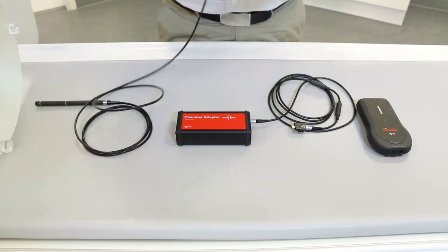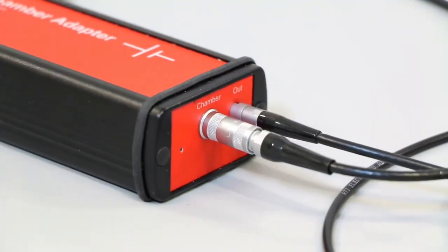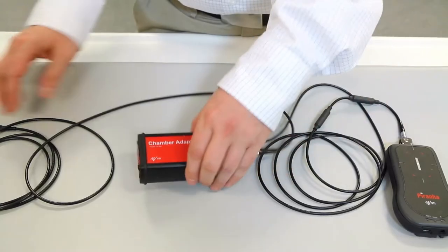To begin your first measurement, plug in the CT-Ion chamber to the chamber adapter. Connect the chamber adapter to the piranha and switch on the chamber adapter.